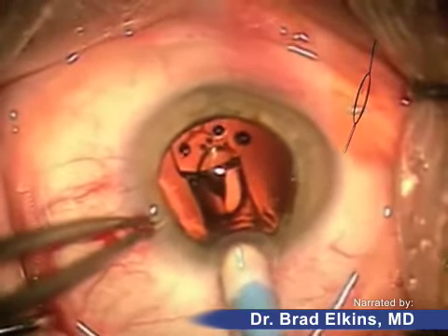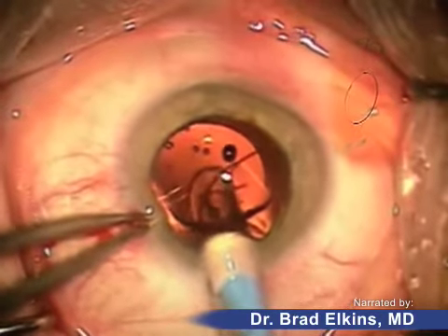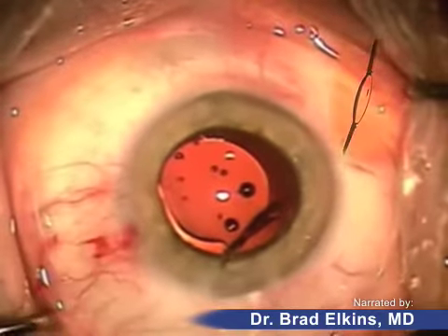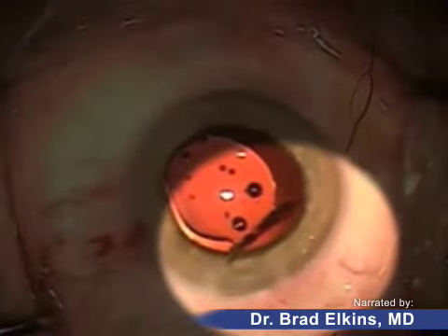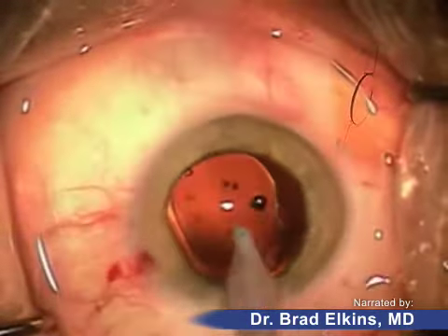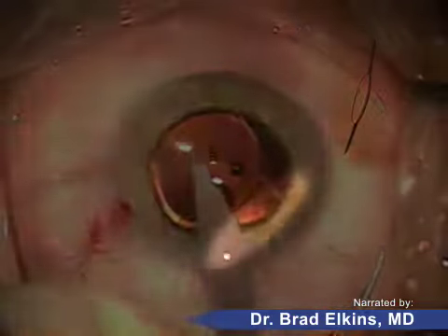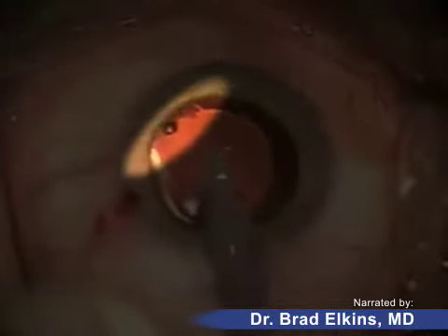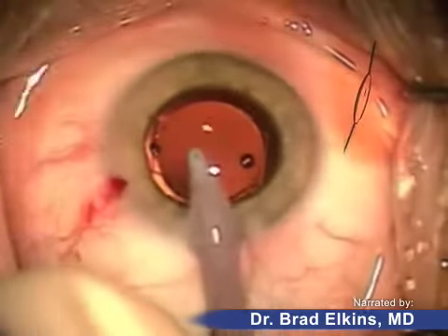As you can see, the haptics are out and now the lens is going to pop out — it's typical for it to pop out that quickly. This is the intraocular lens optic, and as you can see, the haptics are attached to a hinge-like device which makes the crystal lens unique. There's a hinge on this side of the lens as well as on the other side, and that hinge is what enables the lens to move forward and back.